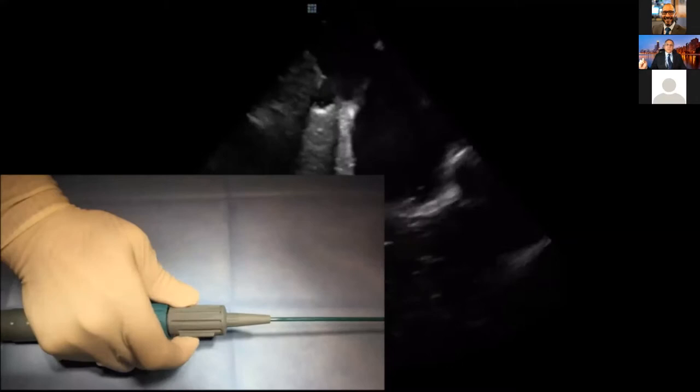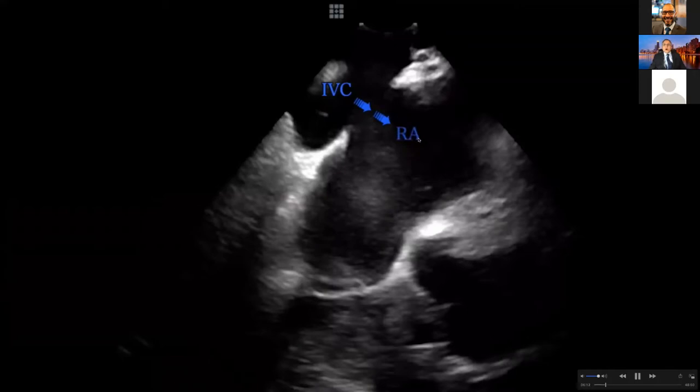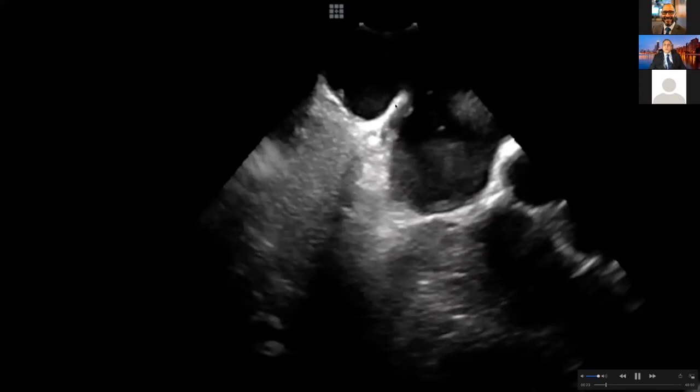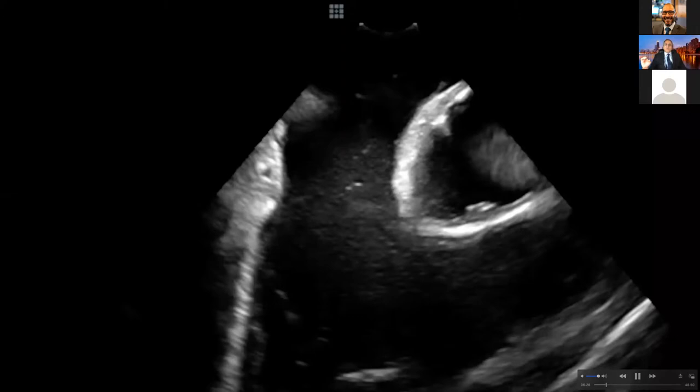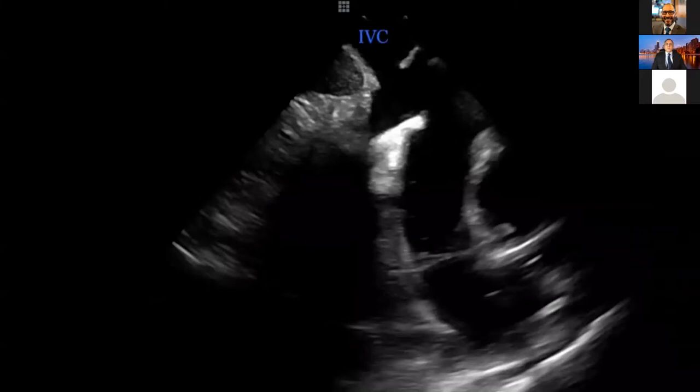Here I'm showing in slow motion — I'm doing the anterior tilt, making the eyes go down, then advancing. Here's another case: IVC, RA, hepatic vein on top, hepatic vein at the bottom. I have to go between the two — this is the gate to the right atrium. I make it horizontal and go right atrium. Sometimes it can be really challenging. Here you can see the challenging case — it's a zigzag. Like driving on Lakeshore Drive — you have to go right, left — you have to understand how to manipulate your ICE to go towards the tricuspid valve.